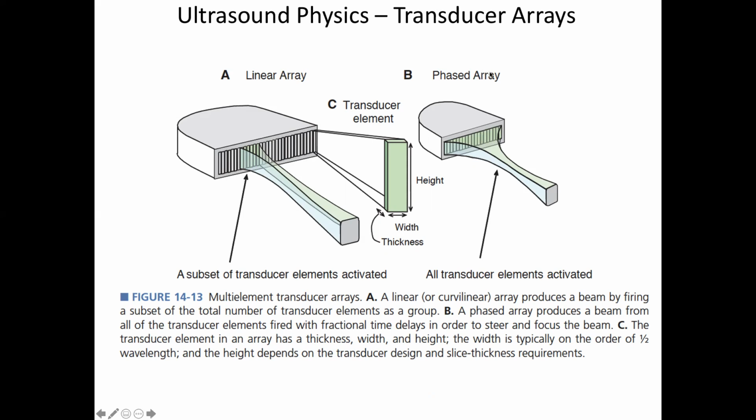More commonly nowadays, these crystals are arranged, and there's electronics in here that change the phase of the vibration of the crystal depending on its position in the array.